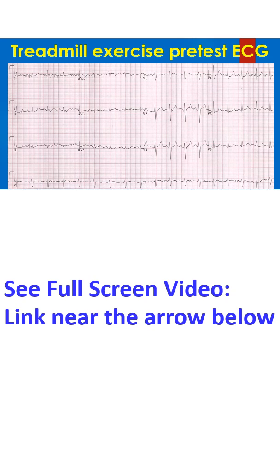This pretest ECG of a treadmill exercise test series shows some artifacts, especially in leads 2 and 3. The pretest heart rate is about 100 per minute, possibly due to apprehension.